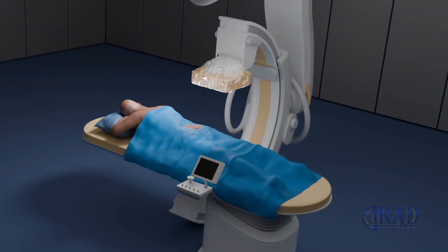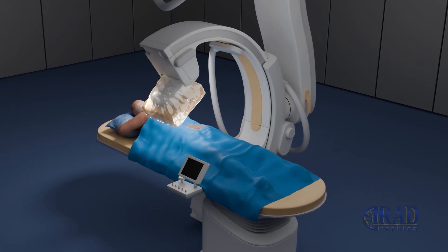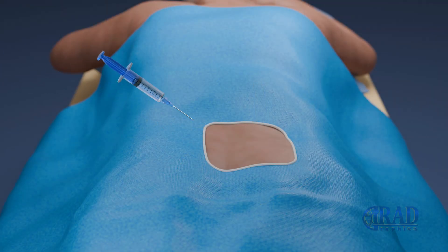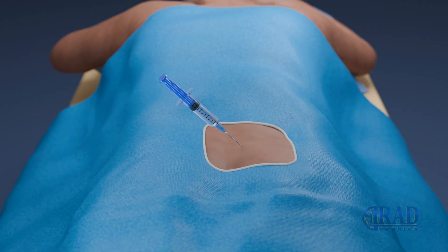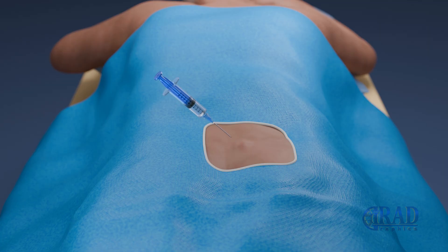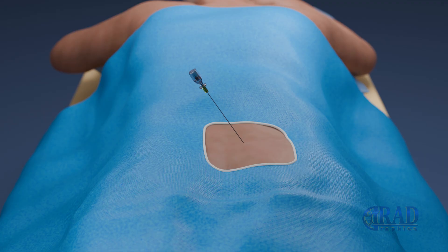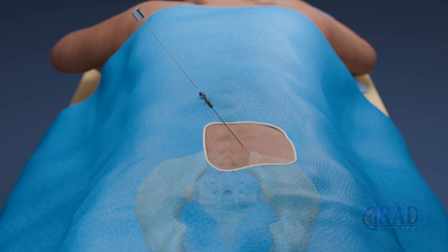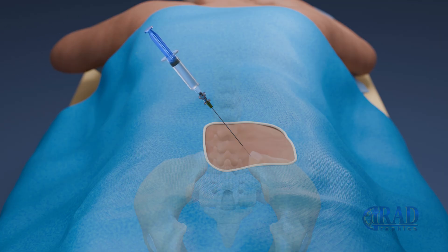If using fluoroscopy for guidance, the proper trajectory for needle advancement is identified. Then, local anesthesia, such as lidocaine, is injected to numb the skin, followed by numbing the subcutaneous tissues and periosteum using a Chiba needle, ensuring patient comfort during the procedure.